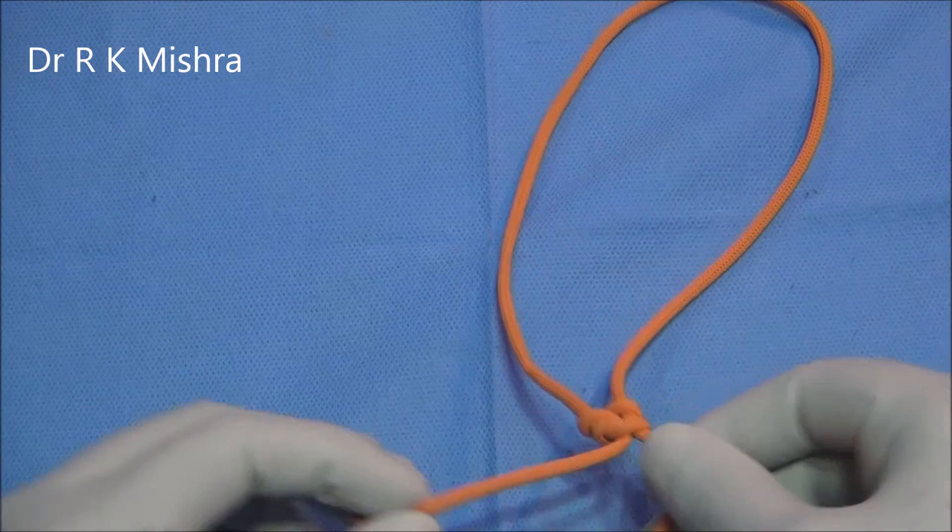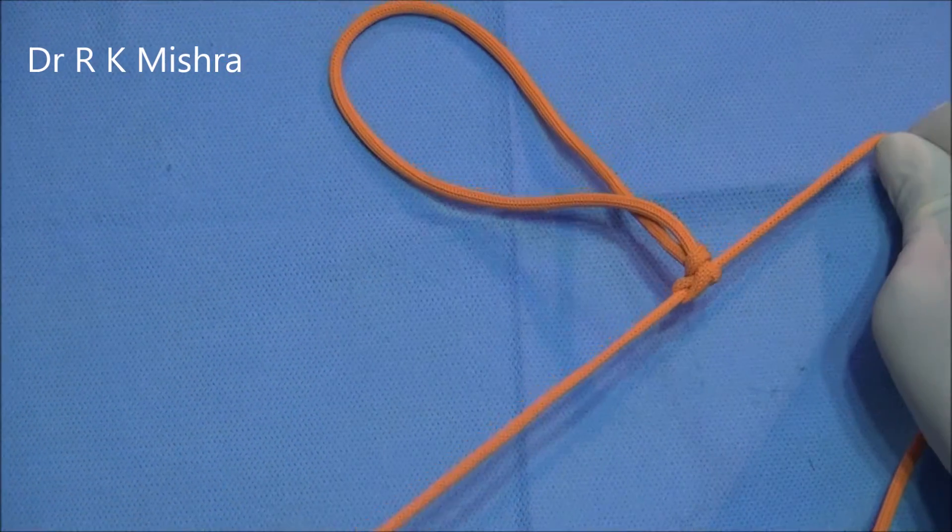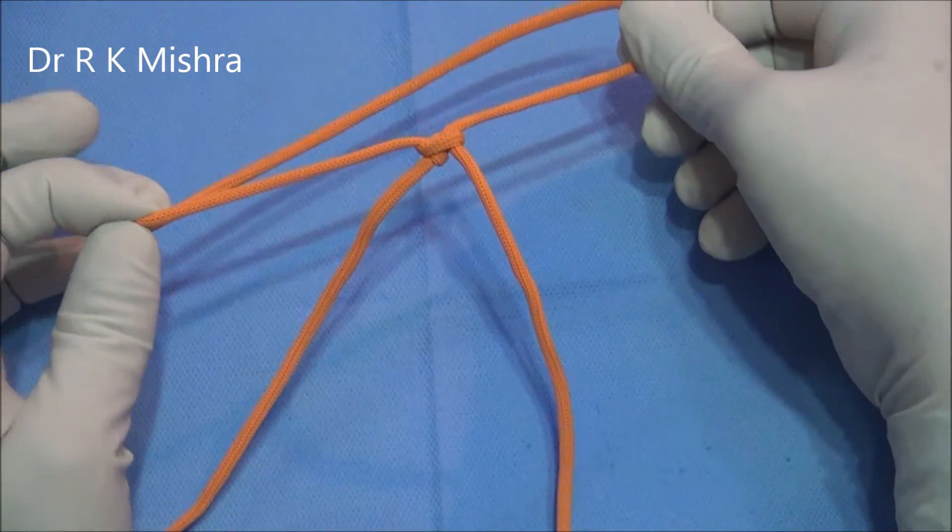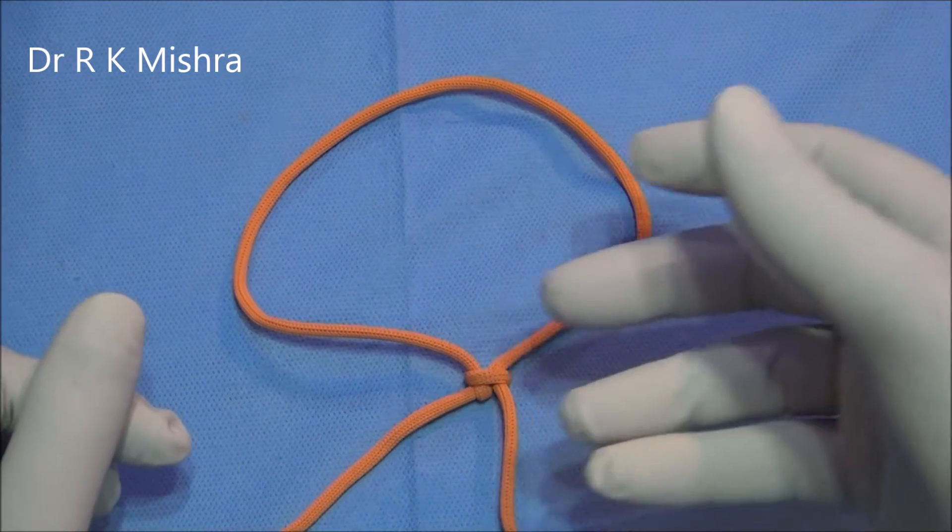The good thing about the knot is that once it goes to the tissue and you pull it, it will become locked. After that it cannot come back. It is a lock knot, not a slip knot, so you don't have the problem of it slipping back.